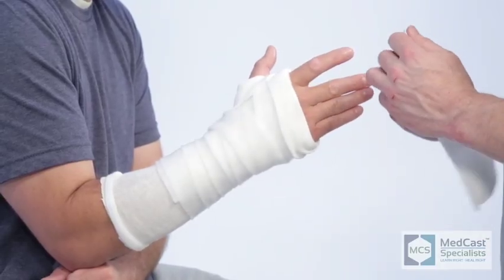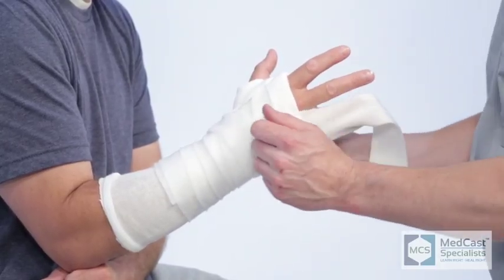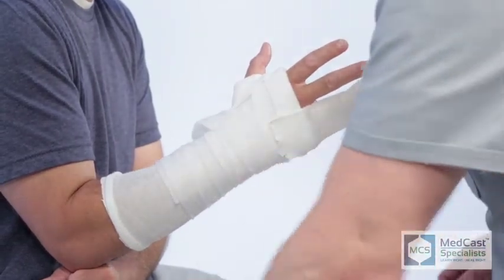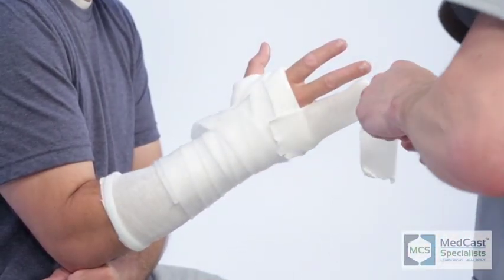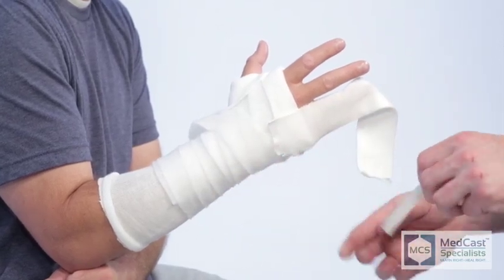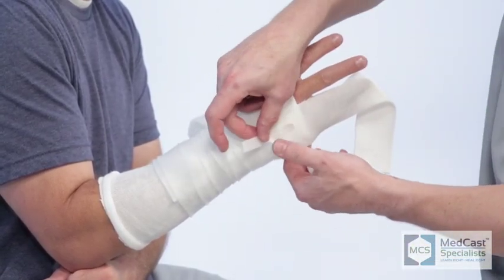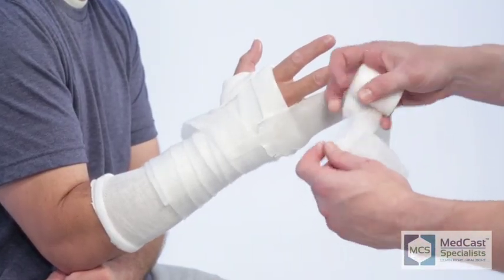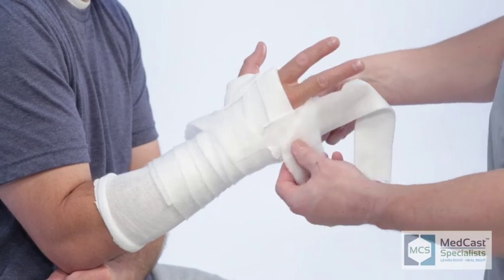Once you find these techniques, they just make the application so much easier. Put a couple of them on, see how the process goes, see the patient satisfaction — it's rewarding. It's all about rhythm on these short arm ulnar gutter casts as you start to apply the cast material. If you get your technique down, you'll just use that same technique over and over.